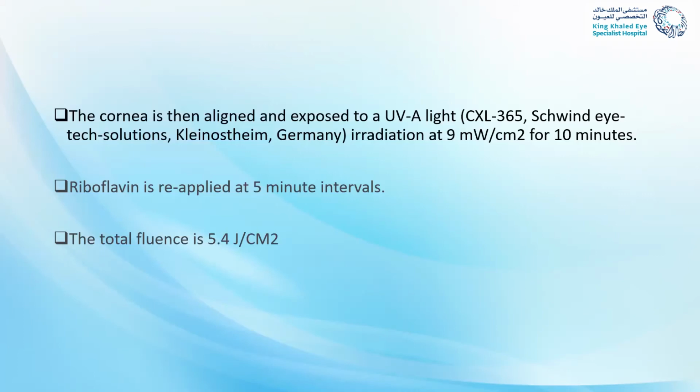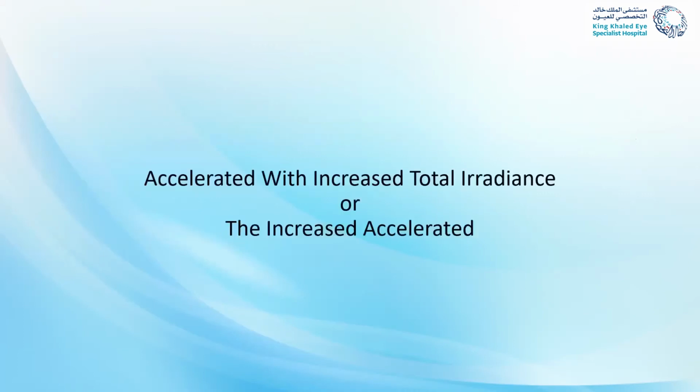So it's 9 milliwatt per centimeter square for 10 minutes. So a higher power with a short duration of time. Comparing both these protocols, they both gave the same efficacy in regards to the outcomes post cross-linking.